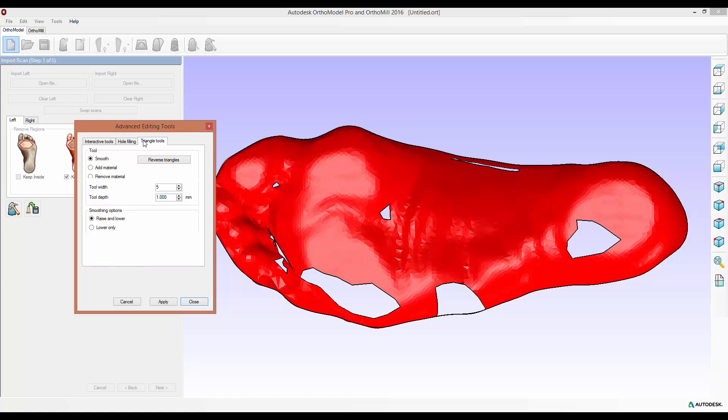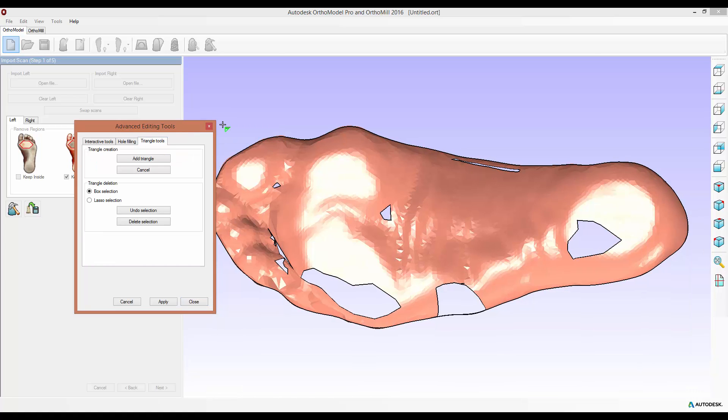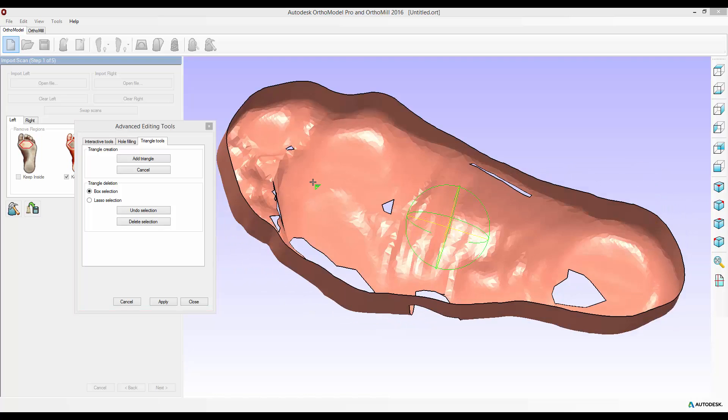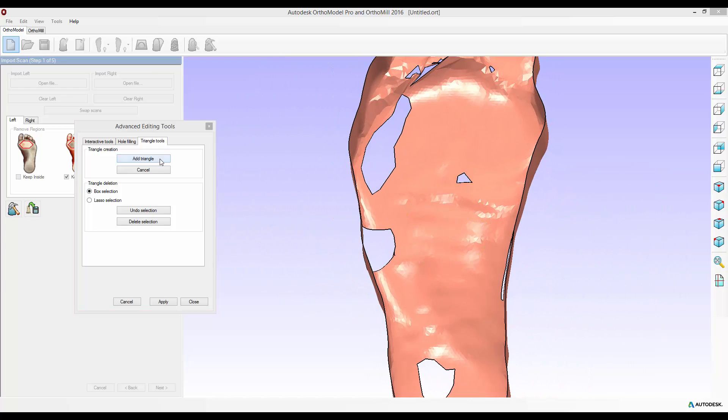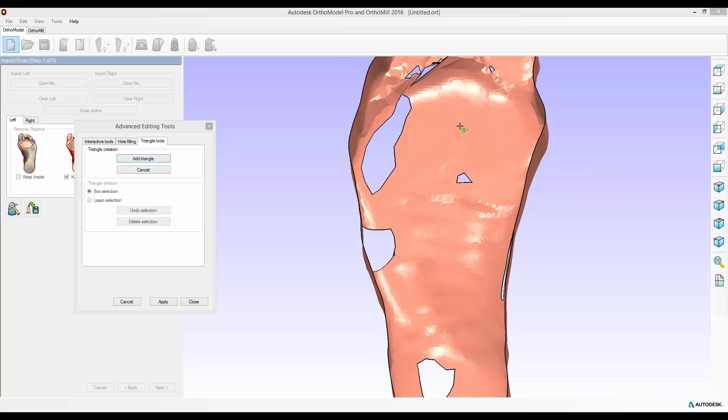I'll cover the latter of those first. The triangle tools options allows you to add a new triangle based on three defined points or delete a number of triangles from your scanned mesh. The triangle creation works by selecting add triangle, you enter triangle creation mode, click three times and it'll create a triangle between those three points. You can keep doing this over and over again until you select cancel within the form.